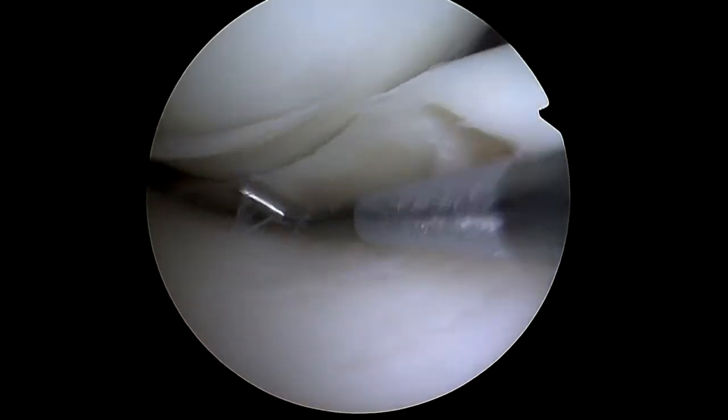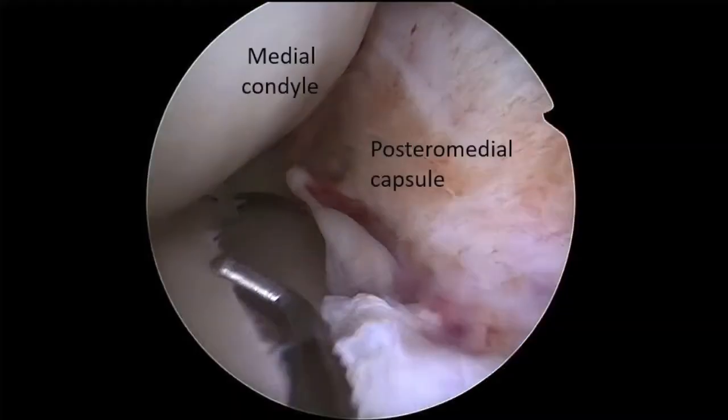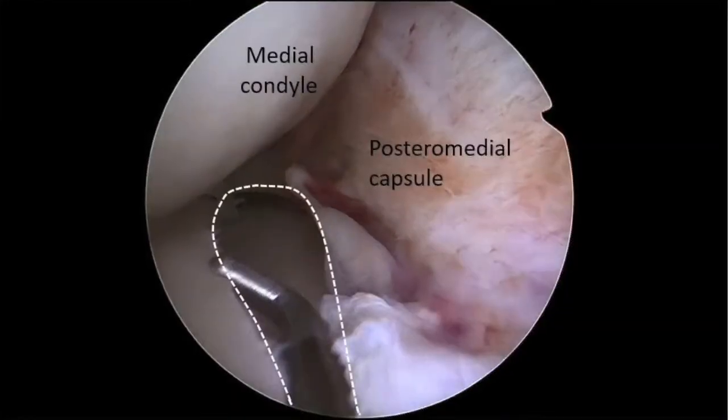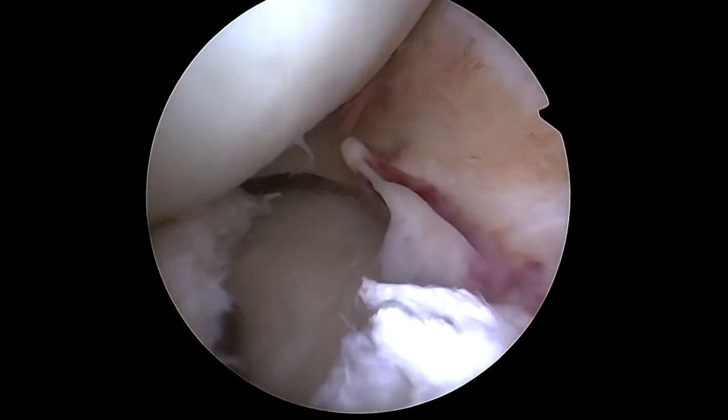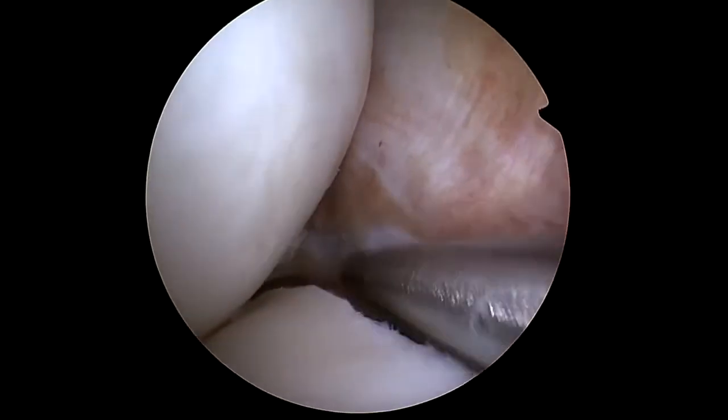In this second example, the same technique is used to repair an extensive longitudinal lesion of the mid-body of the medial meniscus. The debridement is performed with a 4mm motorized shaver.